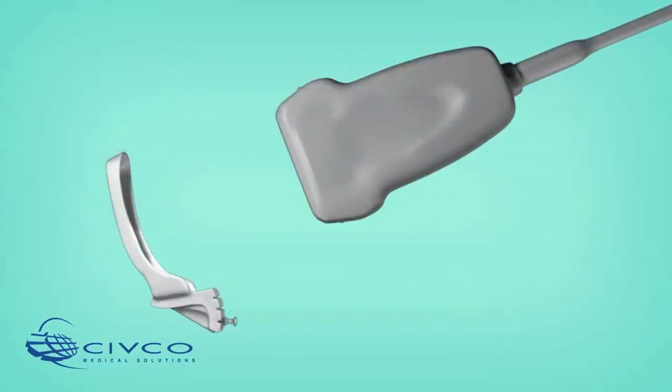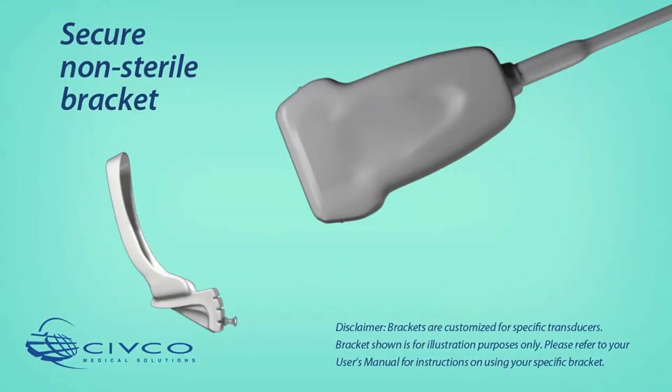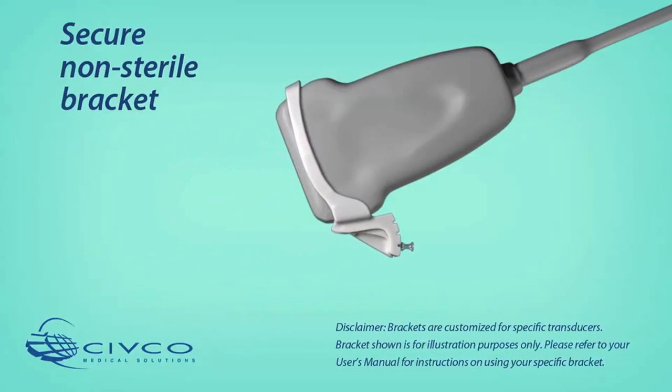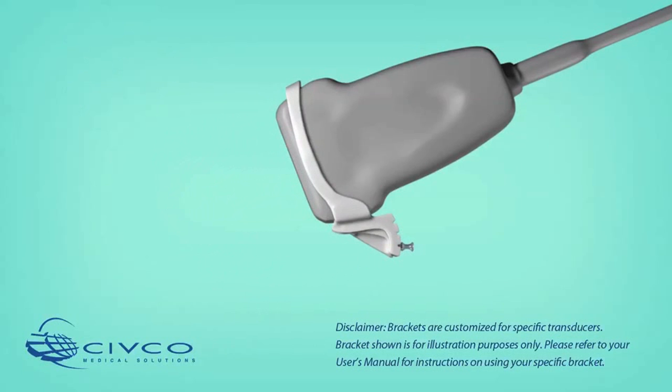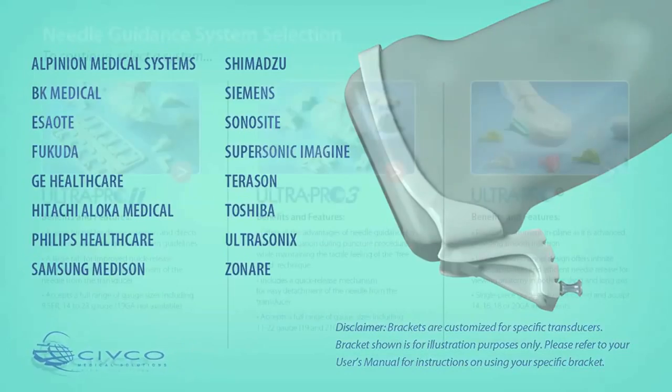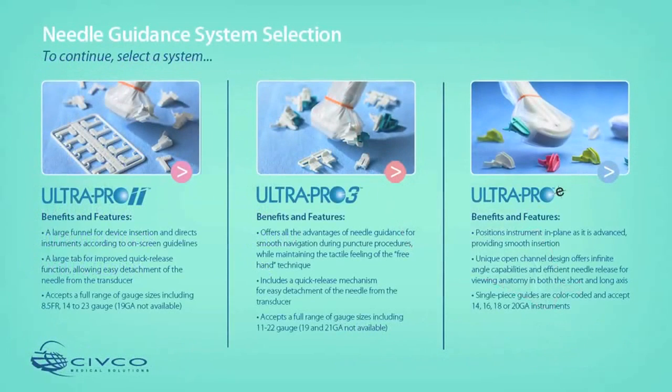Before opening the disposable procedure kit, place the custom, reusable, non-sterile UltraPro style bracket onto the transducer. The bracket should attach securely according to the corresponding locating features on the transducer. UltraPro style brackets are created custom for leading ultrasound equipment manufacturers. To continue, select from the UltraPro needle guidance systems below.